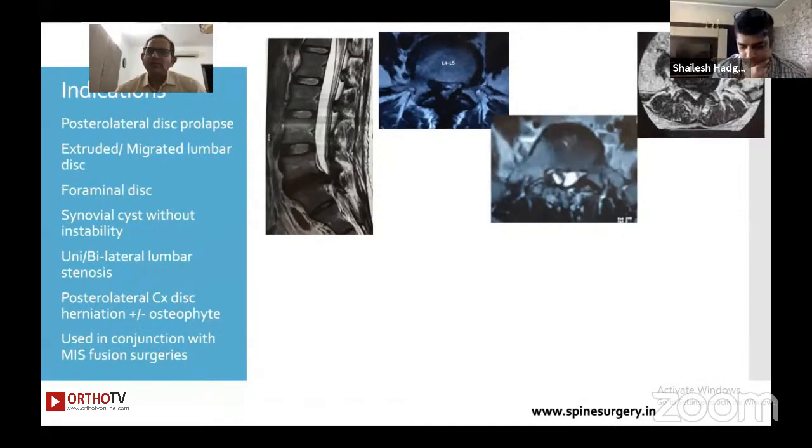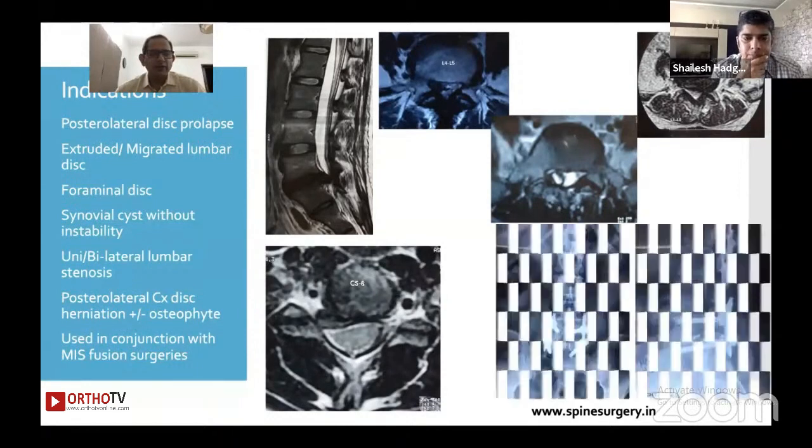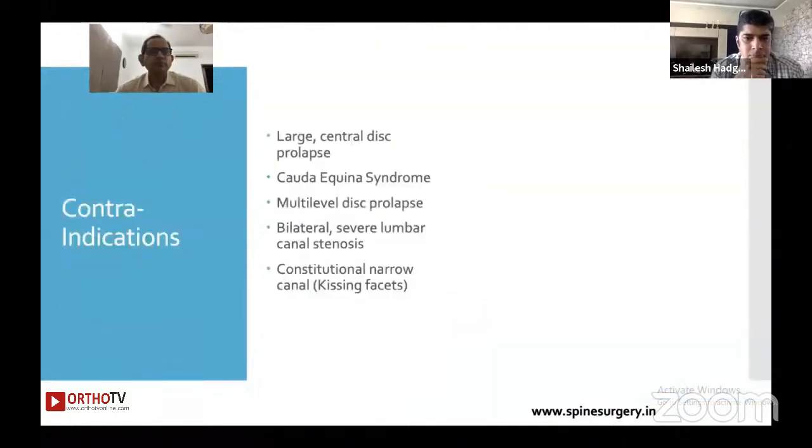Unilateral or bilateral lumbar canal stenosis can also be tackled very well. The posterolateral cervical disc herniation can be managed along with the drilling of the osteophytes through this same technique. This can be used in conjunction with MIS fusions, for the MIS TLIFs as well.